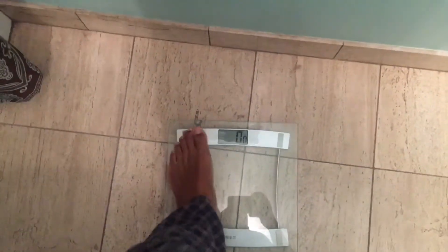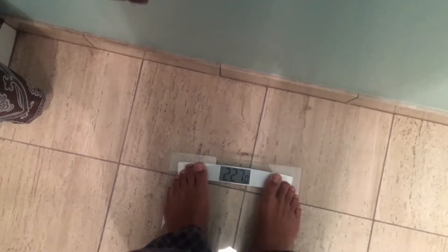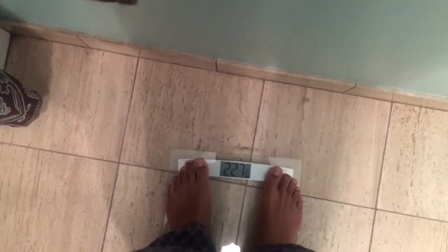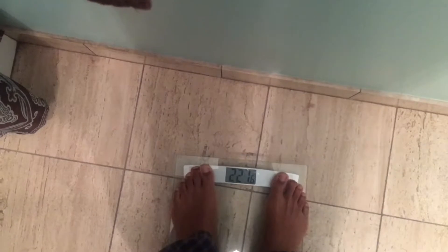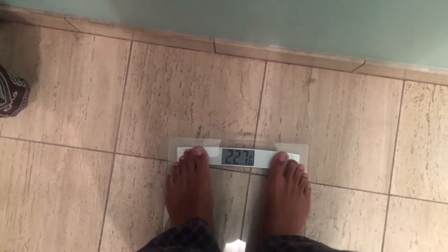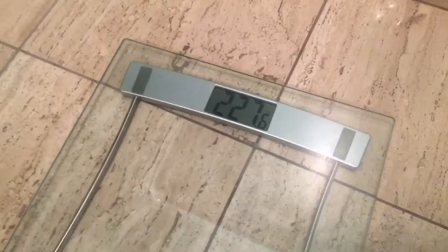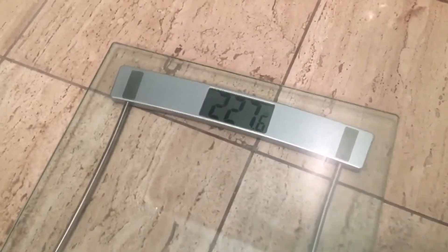I'm just going to go ahead and stand on it. And that's my weight right there — it shows you how much you weigh. I'm going to step off, and the weight still shows up on there so I can jot it down.